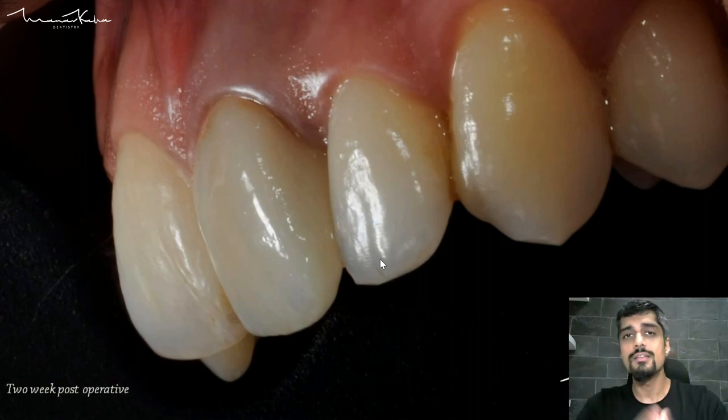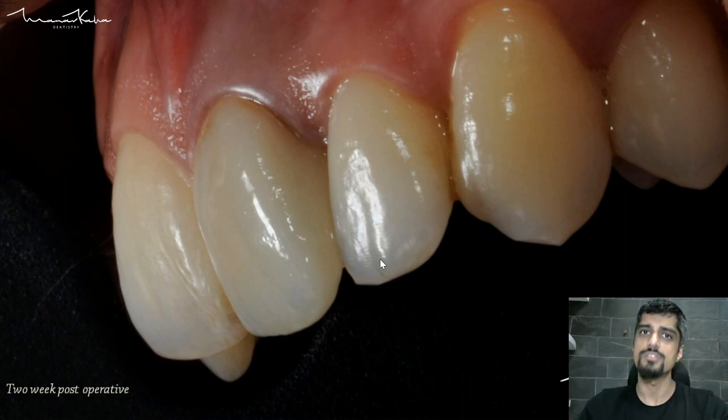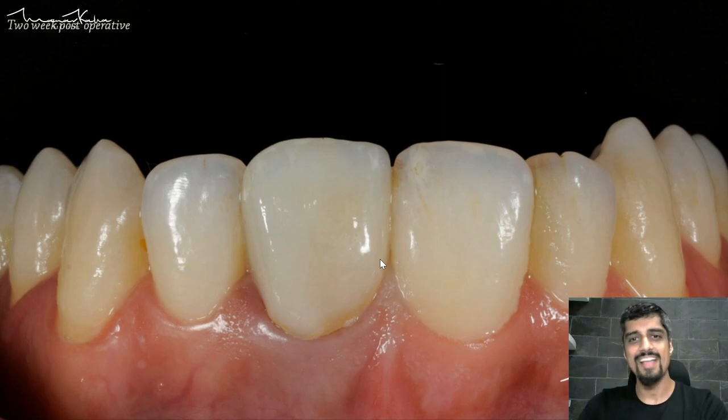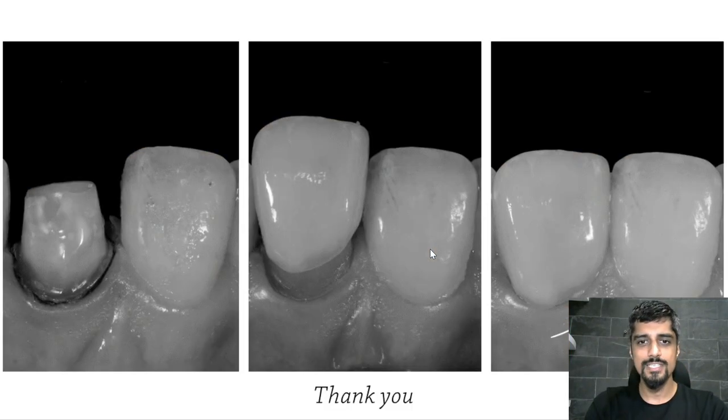We have to provide as much information as possible for our technician to do a great job. You can see the quality of the gingiva and the gingival healing. It's an underappreciated fact that the soft tissue response around all-ceramic materials is just fabulous — soft tissue loves E-max. This is your final restoration. You can see the translucency, a more chromatic area here, and of course there is a slight difference in size as well, but now we're just nitpicking. That's it for this case.